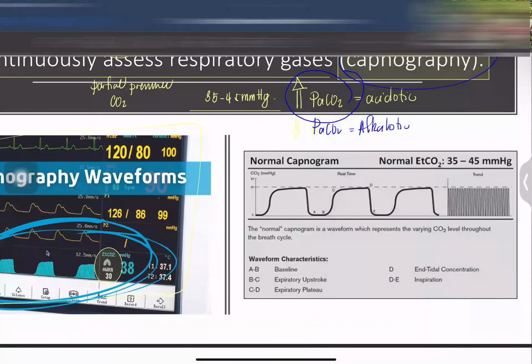So, pag nakita po natin na mataas po yung carbon dioxide, ano pong ginagawa natin? That is for your doctor to modify the settings of your ventilator to allow carbon dioxide to go out. Now, how about naman class pag mababa yung carbon dioxide natin? A very good example class ng pagbaba ng carbon dioxide natin is what you refer to as your hyperventilation syndrome. Acute lang to class ha. This is an acute decrease of your carbon dioxide levels.